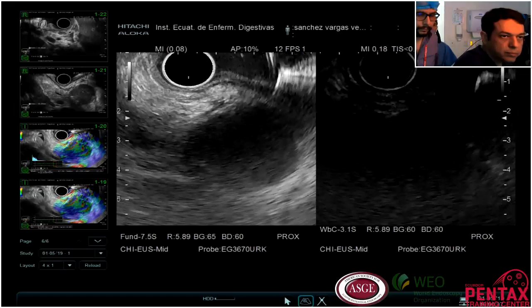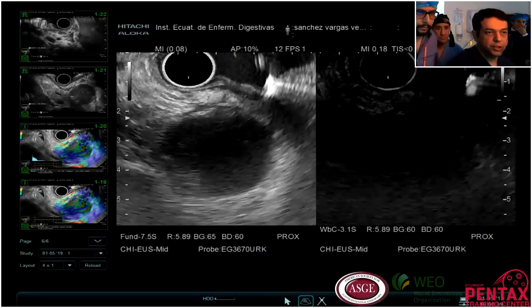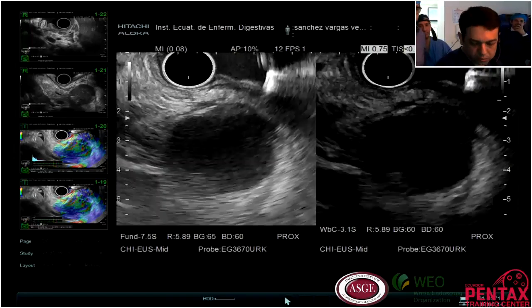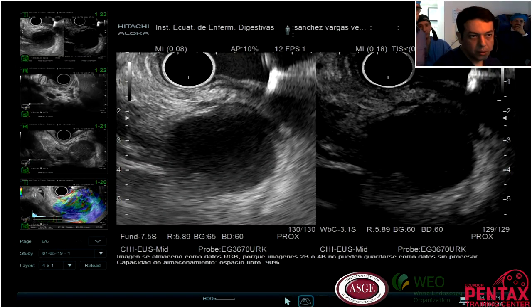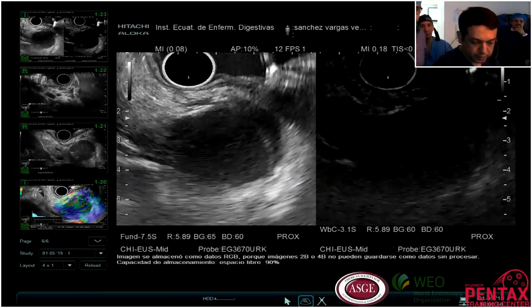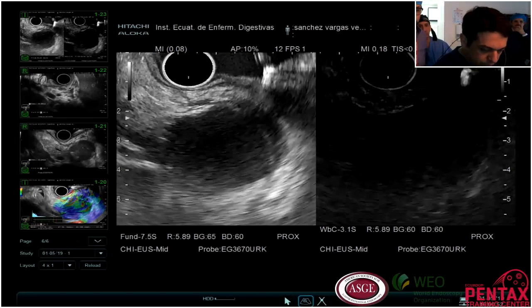So we have the lesion here in the middle. So in your right panel, you will see the contrast arriving. So, puedes pasarlo.